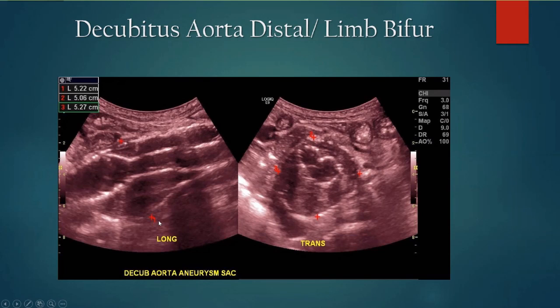Here again are the images required by IAC. When you're taking your widest diameter, you want to show the endograft in your image. And here's our sagittal and transverse. Honestly, the patient imaged really well in decubitus. Actually, that position is a lifesaver on almost all the studies we do. Any renal study, we scan our renal arteries with the patient in decubitus. It's less pushing than the patient being supine, and it just seems easier. All the bowel gas and the belly seem to roll out of the way.